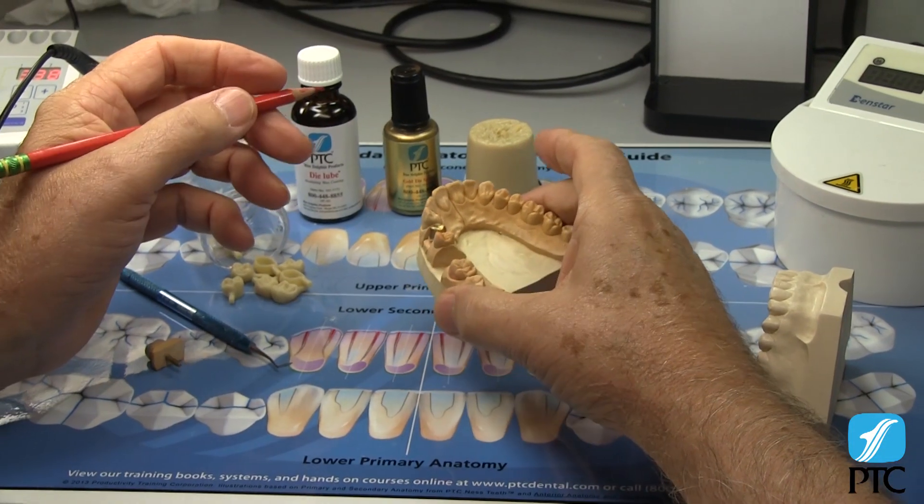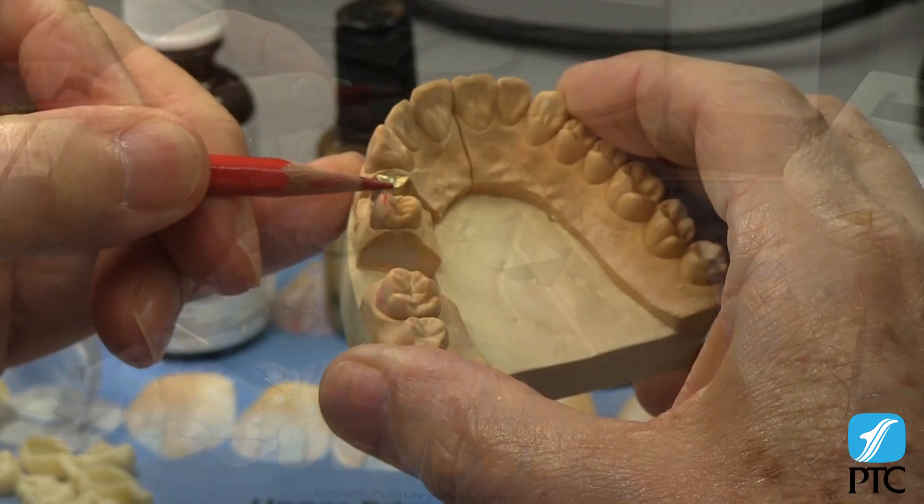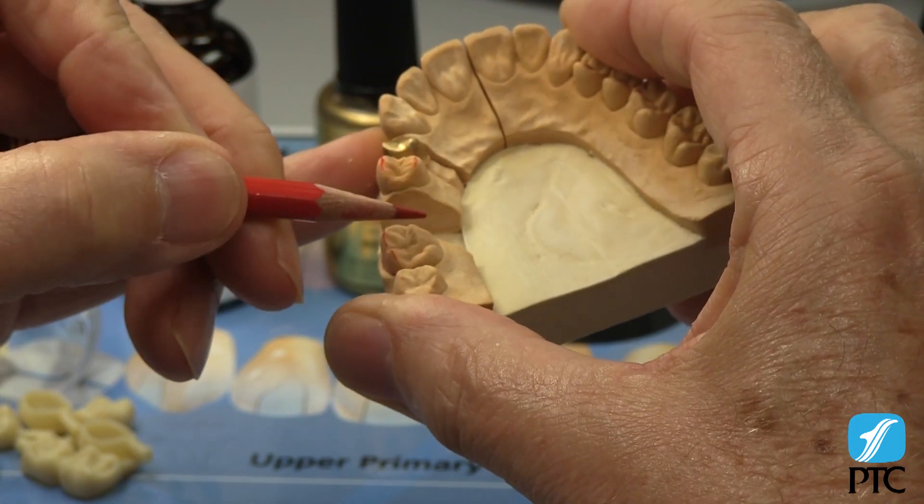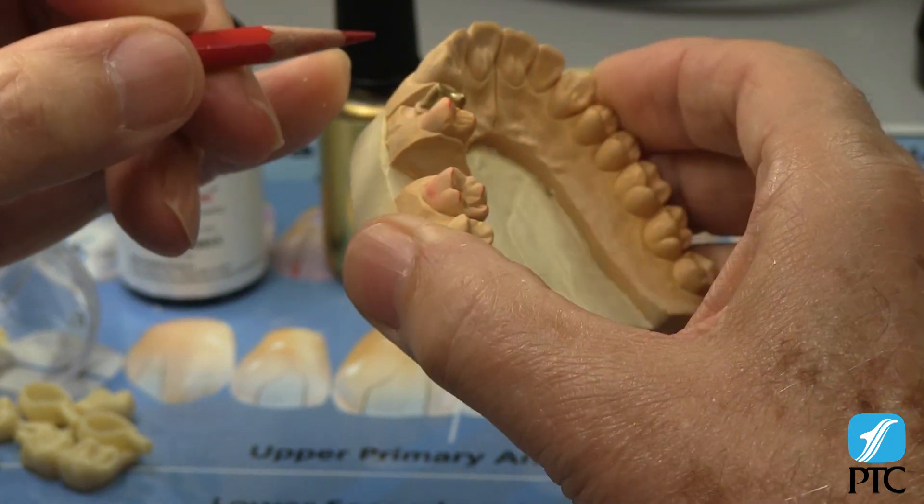It is important that models be marked to establish guidelines that will allow us to quickly verify accurate measurements. Here we are marking the position of the cusp tips and the buccal and lingual heights of contour.